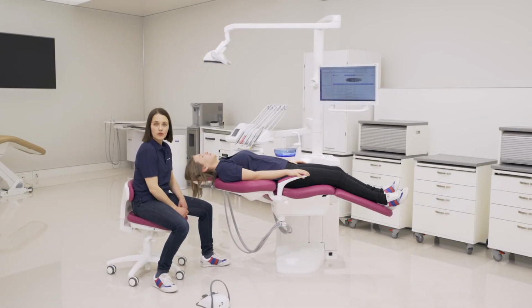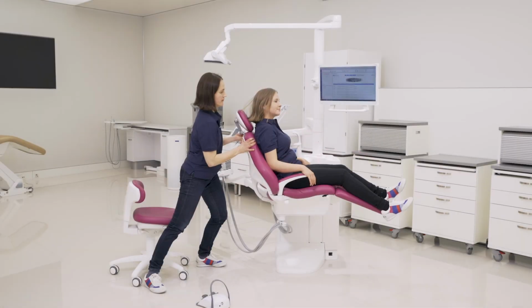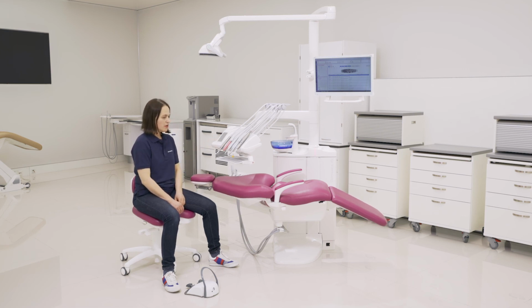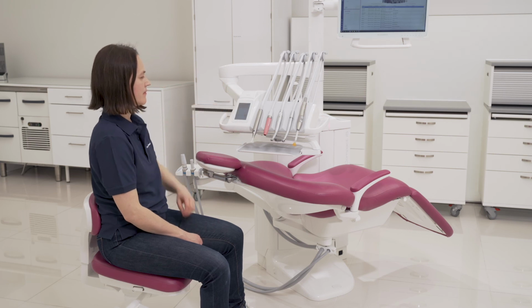In case of emergency, you can get the patient up quickly by pushing the backrest up manually. For whatever reason you have to stop the chair movements, you can do it by pressing any of the foot control buttons or by pressing anywhere in the user interface.